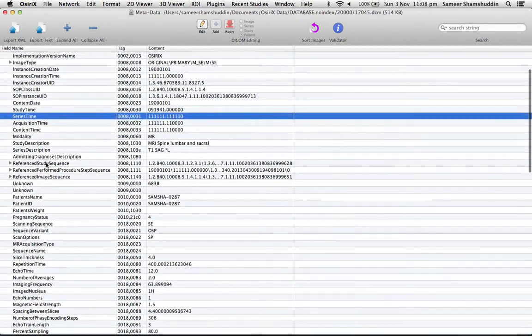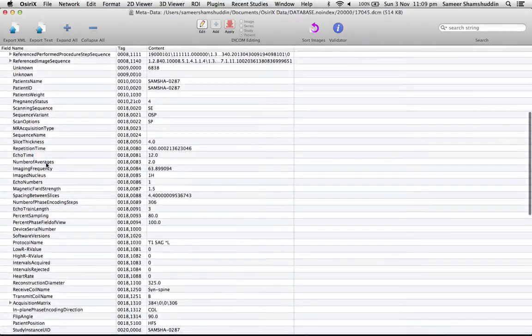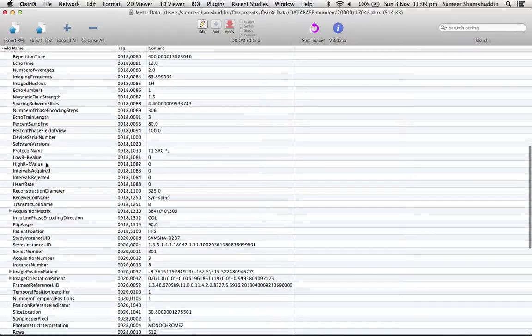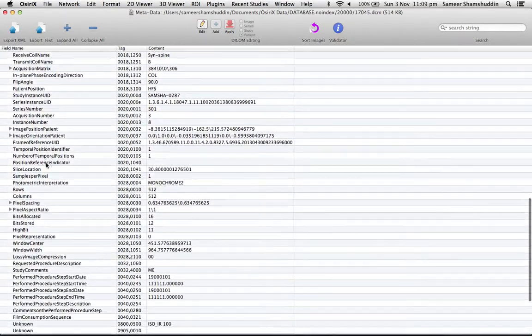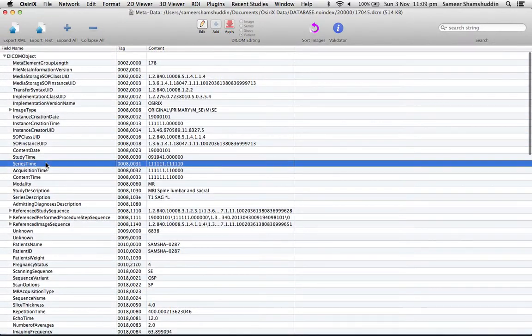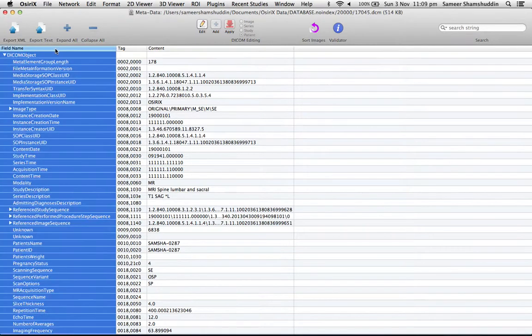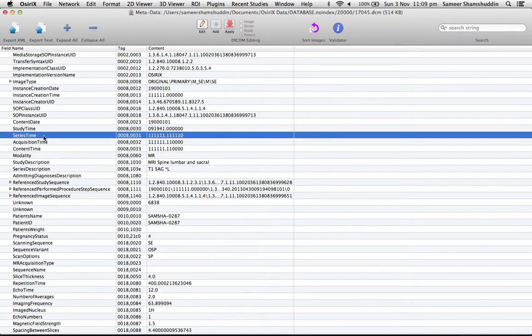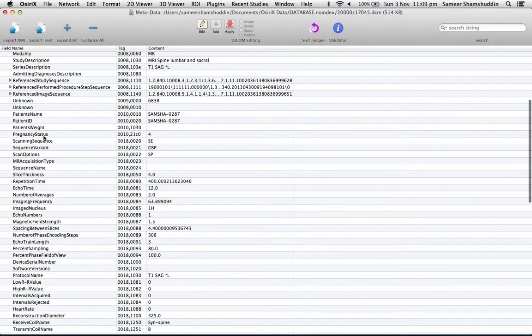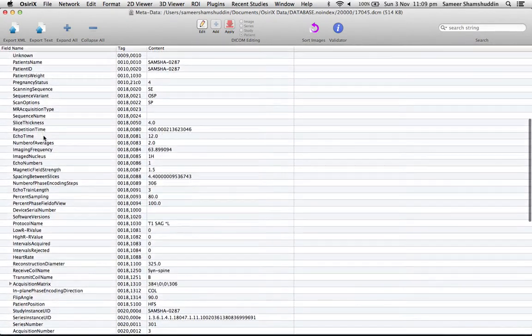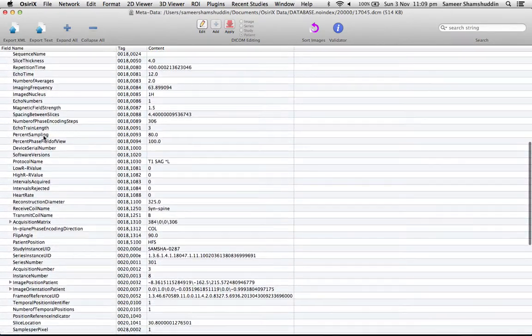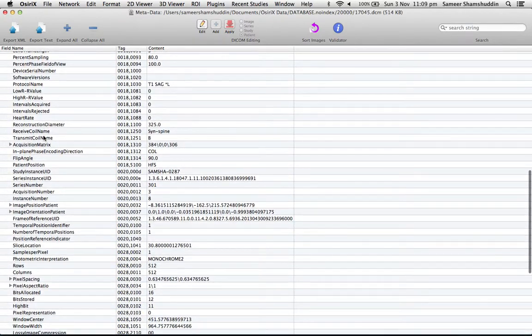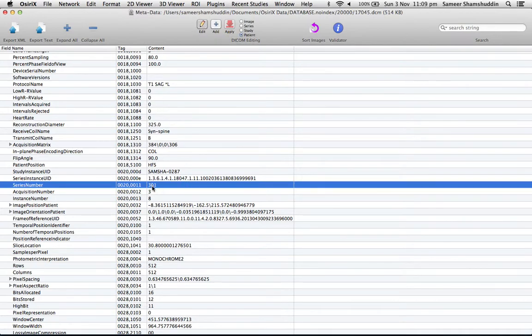I'm sure there is a tag called series number. Let's do it this way. There you go, that's the series number.